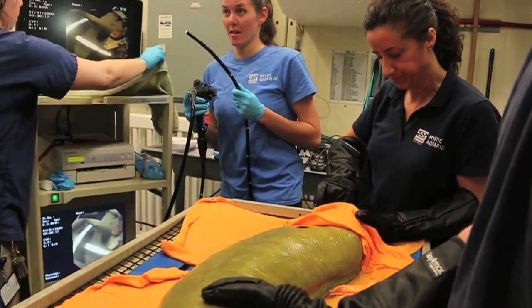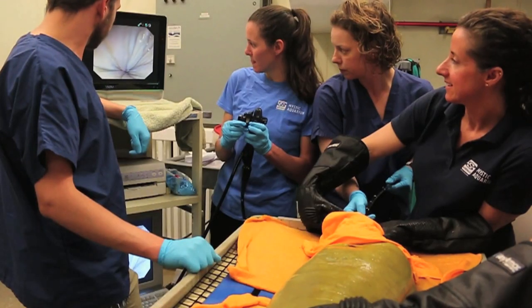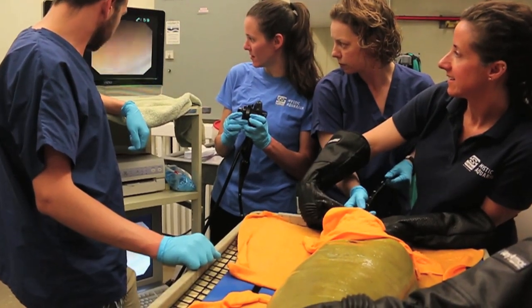Moray eels are prone to gastric polyps, which are little skin tabs inside of the gastrointestinal tract that can interfere with their digestion. So we'll actually put a camera or an endoscope down their throats and into their stomachs so that we can get a look at the tissue in there and make sure that it's healthy enough for them to continue to function properly.